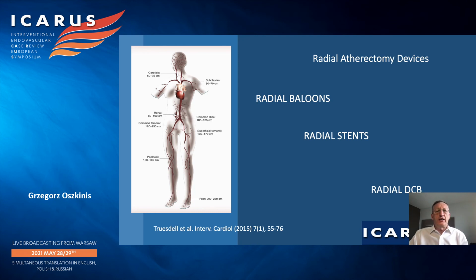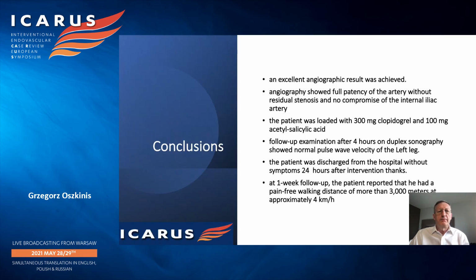Of course, on the market, so far there are not too many devices for the radial access operations going below the femoral artery. But I think the future will be much better.